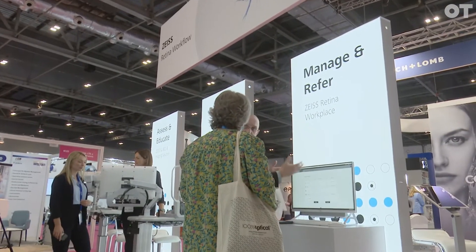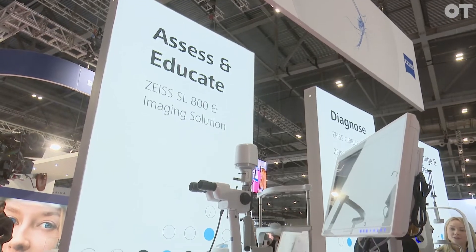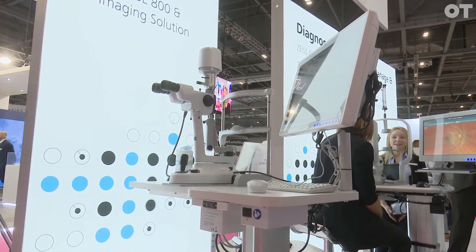We're talking about workflows this time — glaucoma and retinal workflows. Starting off with what you do at the very start: you assess and educate your patients using essential line products, autorefractors, and the lens meter. This is our new premium slit lamp with Zeiss optics and an imaging module, which is really nice for recording anything you want to record for your patients.